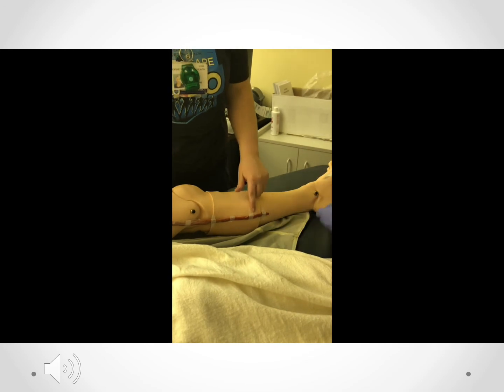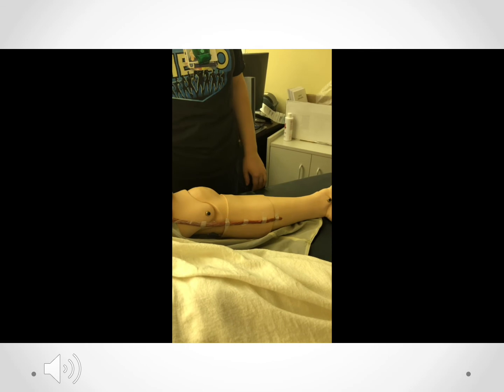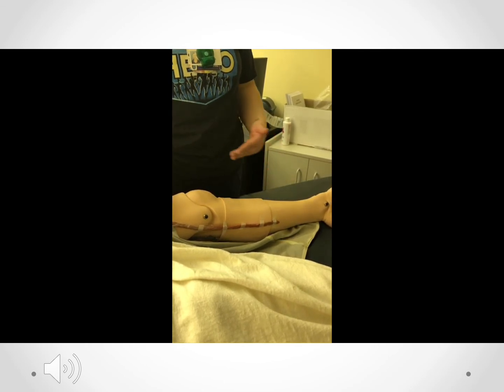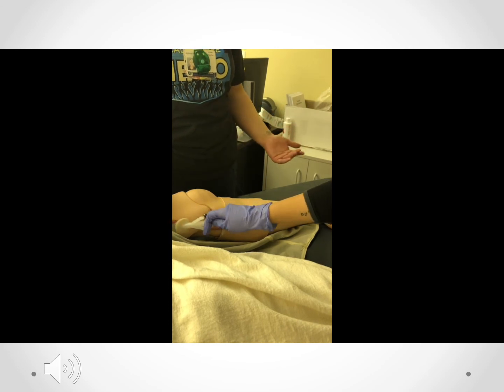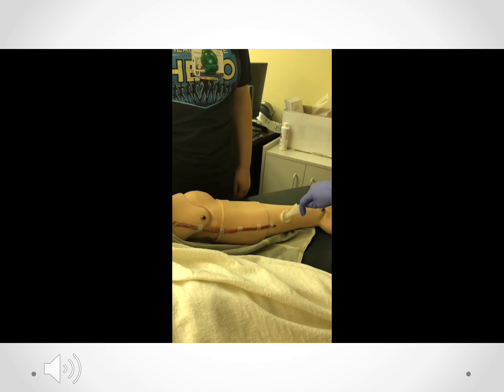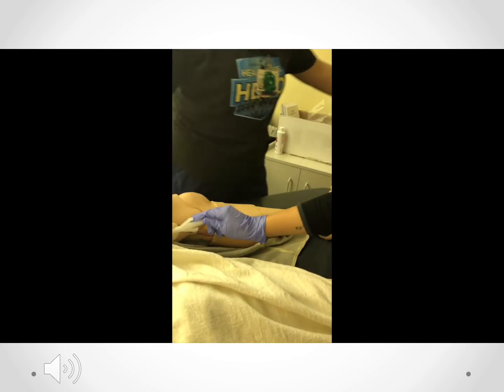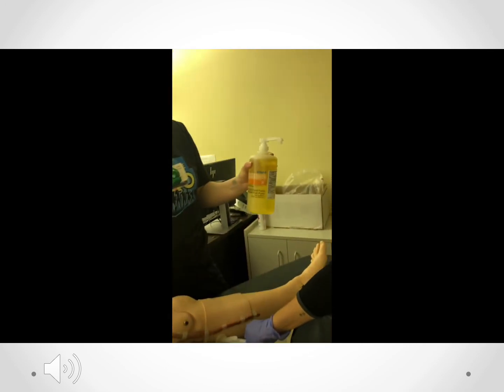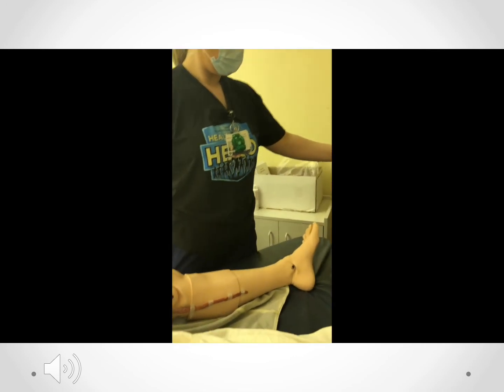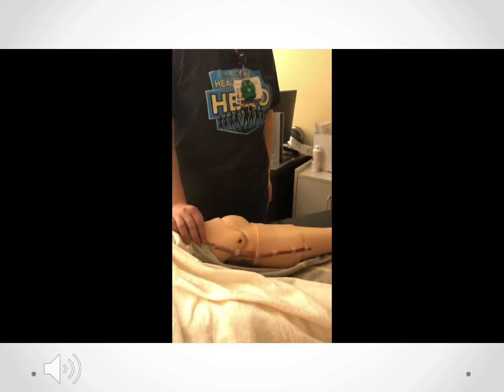And as you can see here, these are the steri strips. These do fall off on their own. We instruct the patient not to take them off. And part of the incision care is that the incision sites get cleaned daily. So if the patient's not showering, we'll use a chlorhexidine sponge to clean the site. If the patient is showering, they can use the chlorhexidine soap in the shower to wash the incision. And then we just leave it open to air from then. Okay.